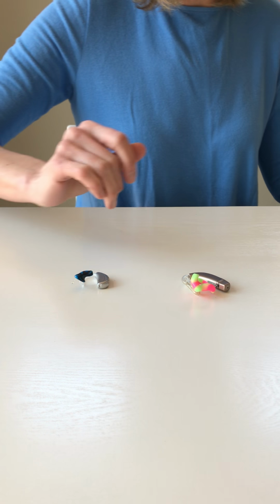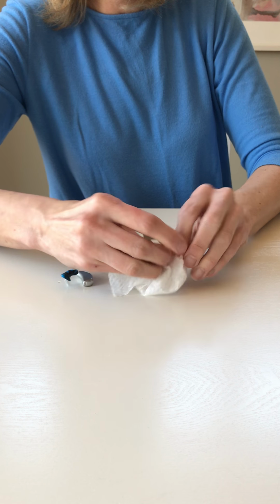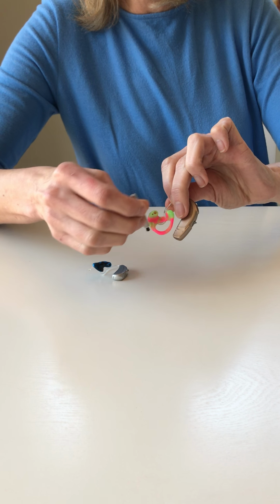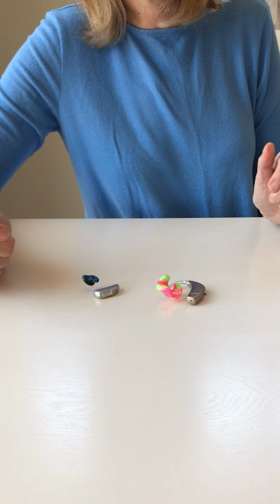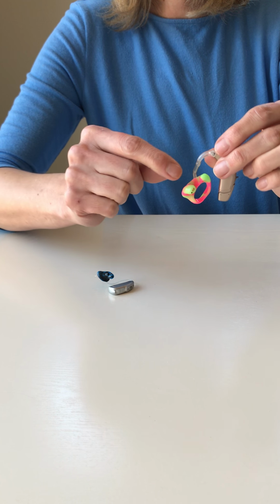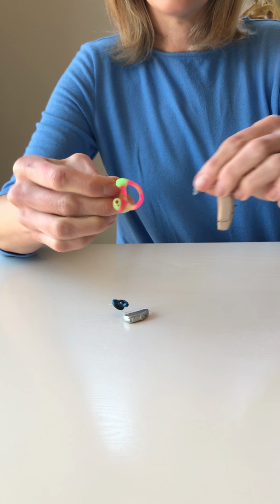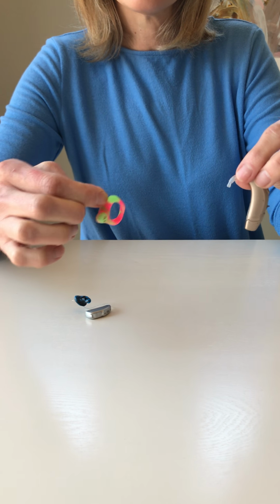Once I see that, what I want to do is I can take a cleaning cloth or a wipe, and I can try wiping the end to try and remove that debris or wax. I can also use a baby toothbrush, or I can use a wax brush or a wax pick to try and clean any debris or wax off of the end. If I've tried both of those and I still am getting no sound or I have very weak sound, then what I'm going to do is I'm going to remove the ear mold with its tubing from the hearing aid by separating these two pieces like that. So I have ear mold and tubing and my hearing aid over here, and I'm going to see what happens.